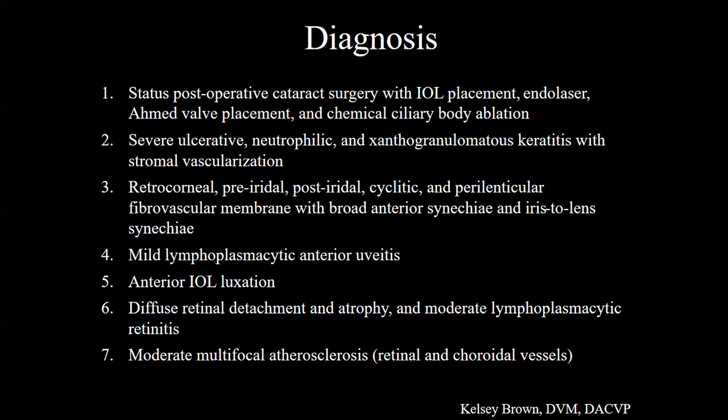Yeah, the corneal lesion is very interesting. I wonder if it's the same thing that happens with xanthogranulomatous endophthalmitis, where it probably started in the cornea with neovascularization and corneal stromal hemorrhage because of the lipid component of the systemic dyslipidemia. Then there's release, there's necrosis, and then the reaction kind of self-perpetuates and becomes the mass.